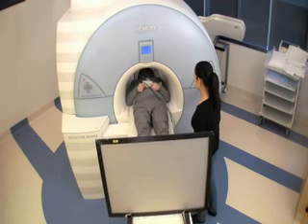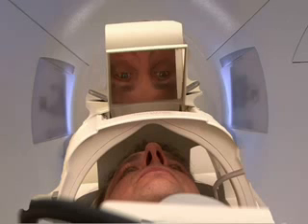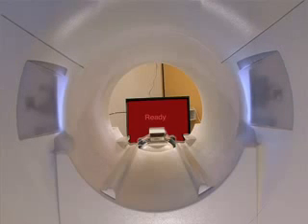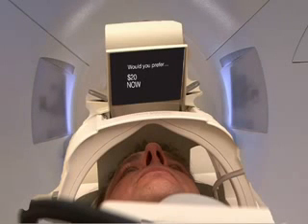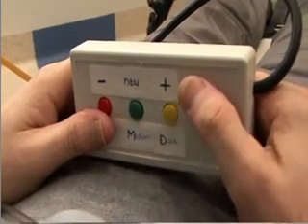To learn which areas of the brain are activated in particular types of decision making, the participant performs a task which involves the specific kind of decision making that we are interested in. The task will involve a number of decisions that involve the same type of thinking process, such as choosing between two different rewards. Functional MRI images captured during the task show brain regions that require more oxygenated blood during the task.